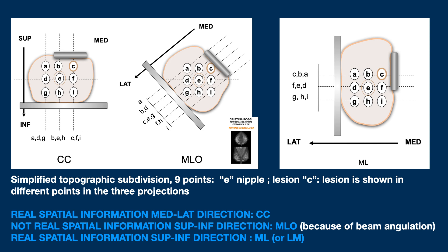It is the right breast. From the CC, we can only see that the lesion is in the inner quadrant. From the MLO, we see that it projects in the same line as the nipple — in the central quadrant. But is this the real spatial information? No, it is not. And it is because of the angulation of the beam.